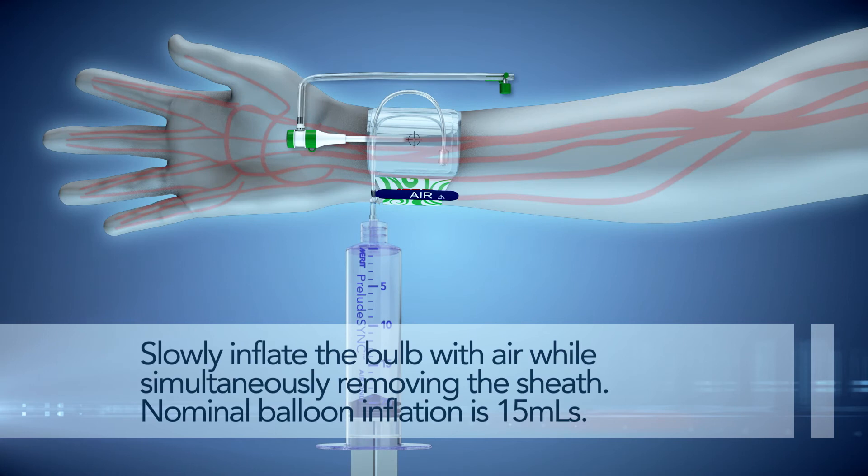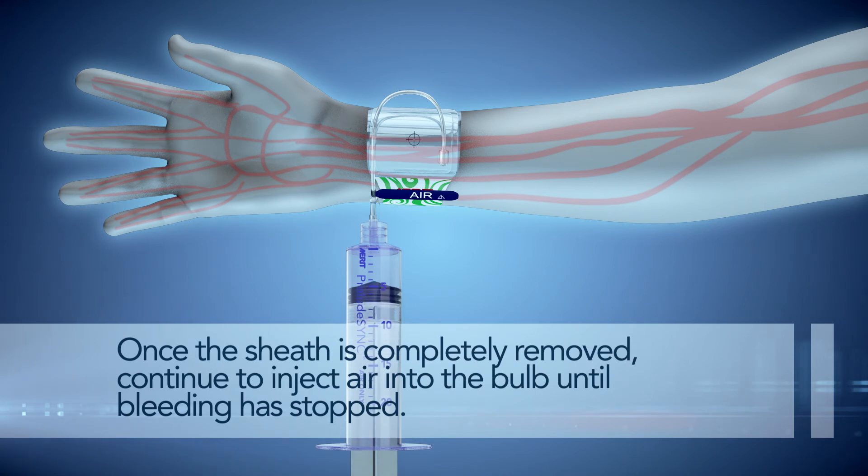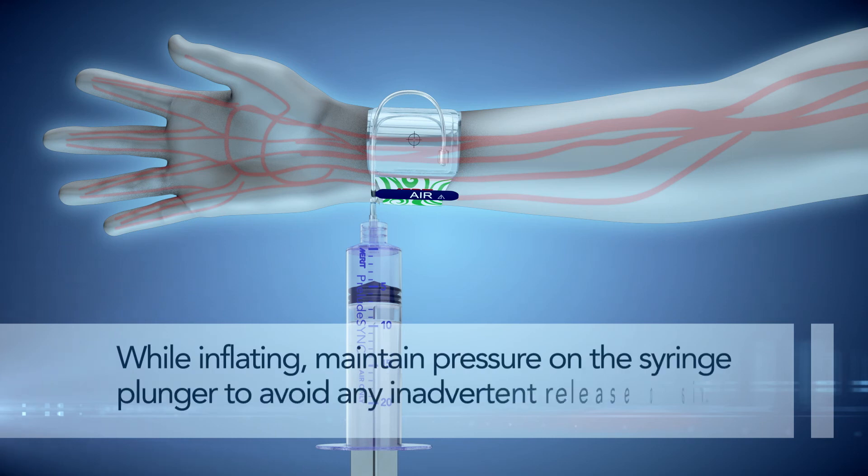Slowly inflate the bulb with air while simultaneously removing the sheath. Once the sheath is completely removed, continue to inject air into the bulb until bleeding has stopped. When inflating, maintain pressure on the syringe plunger to avoid any inadvertent release of air.